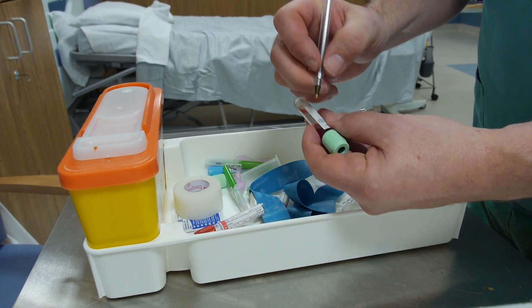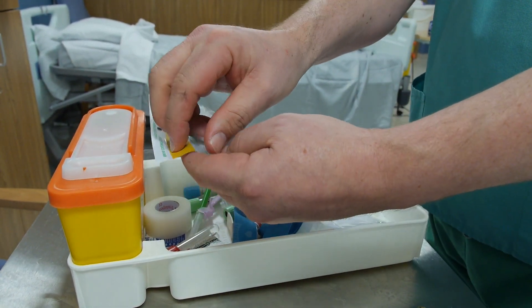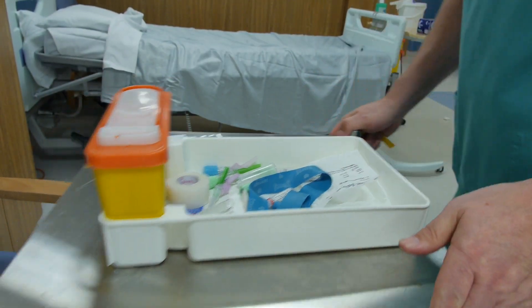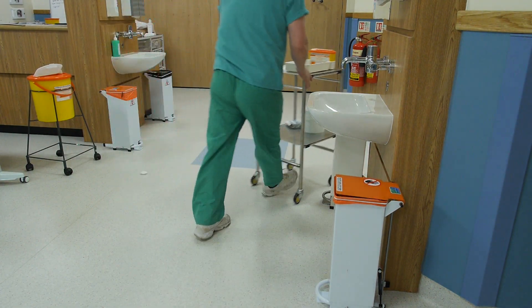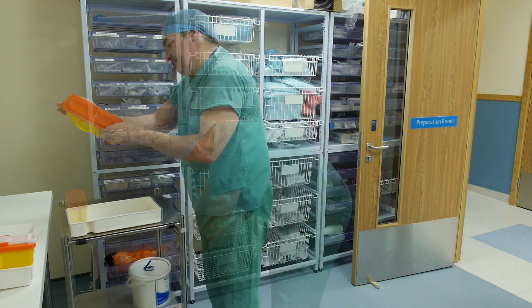Or, if available, use ICE to generate barcode labels for each of the blood tubes being used — this is the preferred method. Dispose of all clinical waste as per your hospital protocol, and it is best practice to clean all equipment at the end of the procedure.